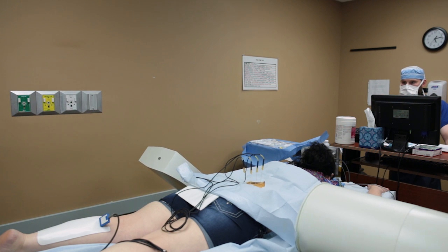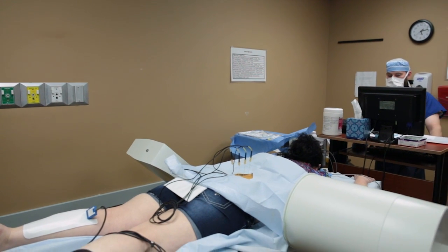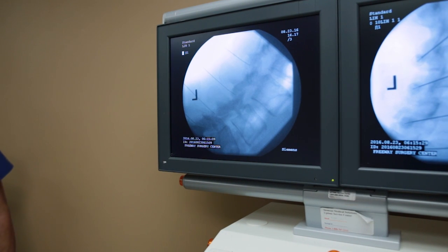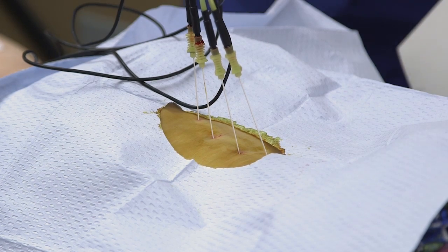Prior to our second rhizotomy we're going to take another x-ray and again confirm the needles are in a good place, then we'll go ahead with our second rhizotomy.